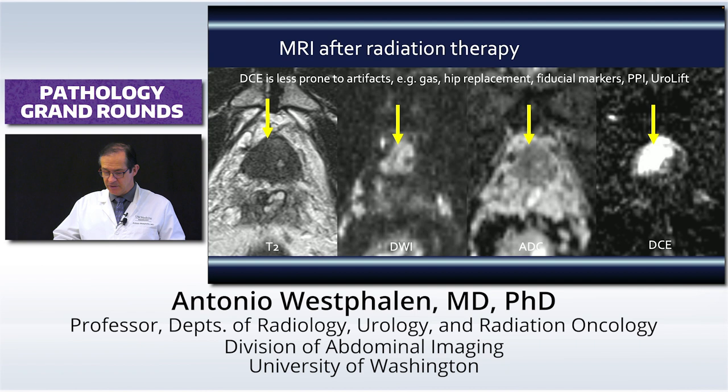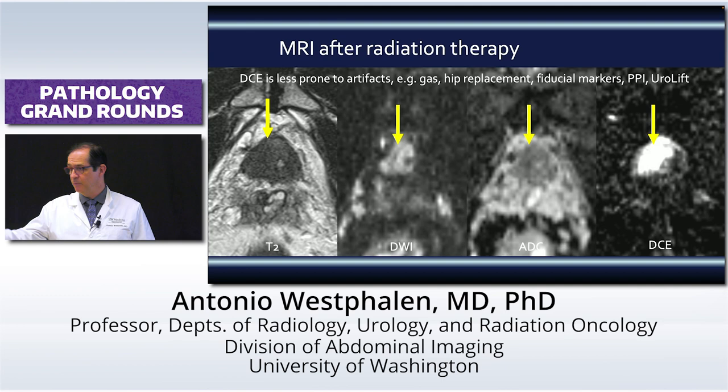And we want to improve our sequences because you can have all these other things happening. Sometimes we have patients that underwent PPI brachy and you have a gazillion pieces of metal causing artifact. So we need to deal with that as well. And again, that matters because we may make mistakes, and then when you get a biopsy, you will have something that you have to look at.